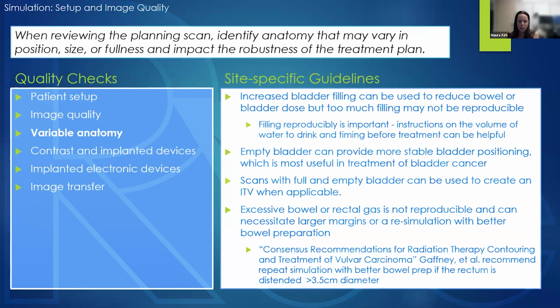And I have a recommendation here from the consensus recommendations for radiation therapy contouring and treatment of vulvar carcinoma. They recommend a repeat simulation with better bowel prep if the rectum is distended greater than 3.5 cm in diameter.